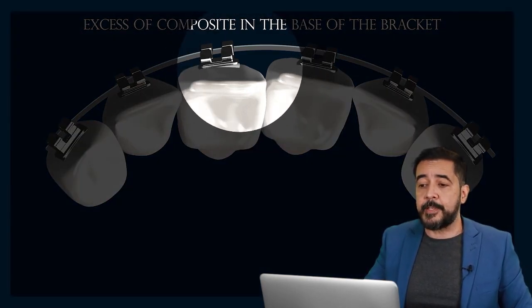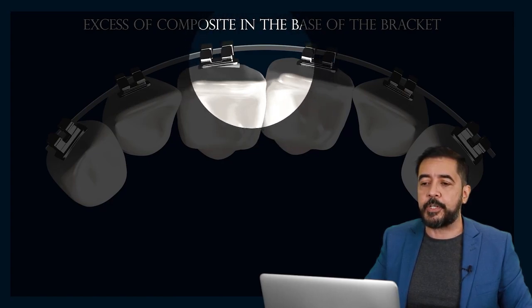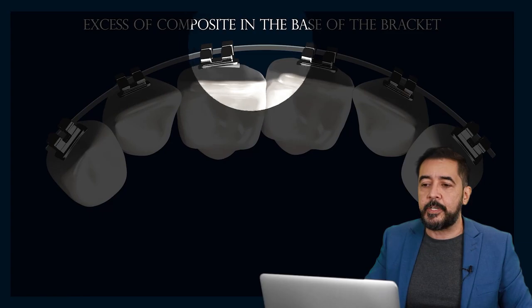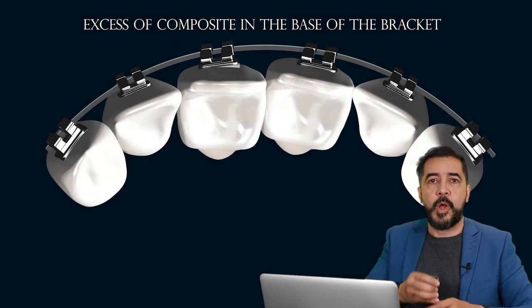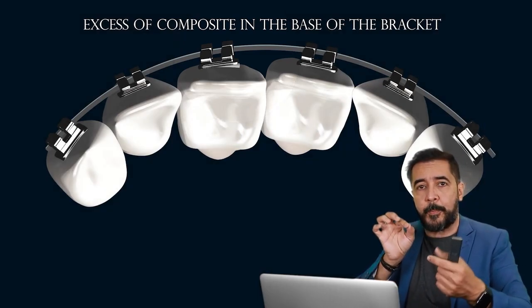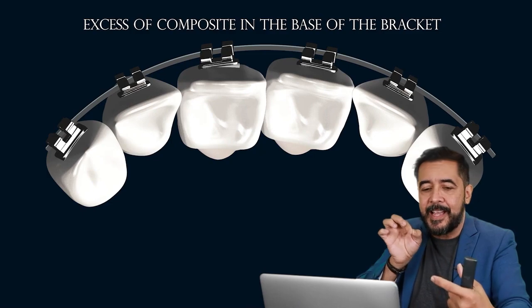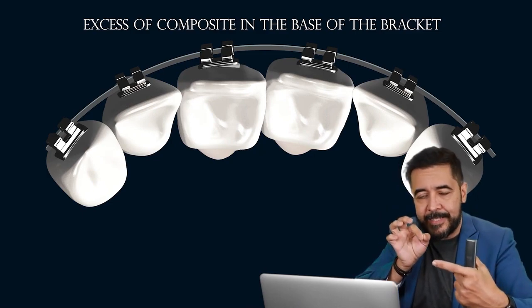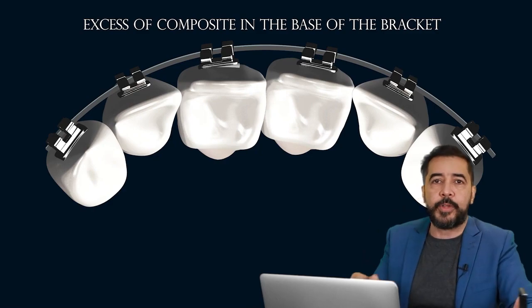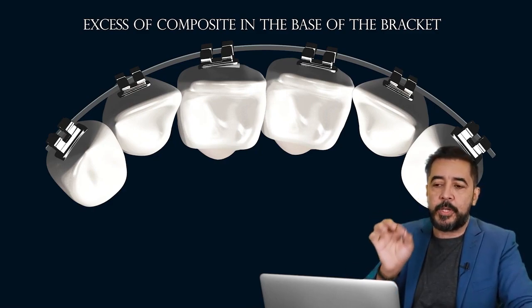So in this case, you have this palatal movement of the medial part of the central incisor because you have this excess of composite in the base of the bracket. So when you put the bracket, you have to make sure that you are squeezing the bracket in opposition to the tooth. So it goes like this, and you have to remove all the excess that is incorporated during the bonding process.